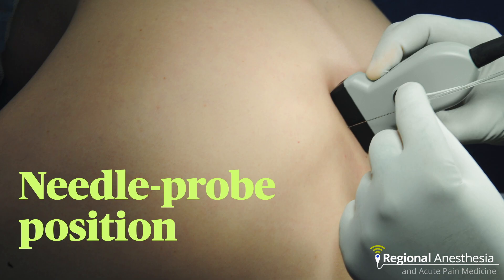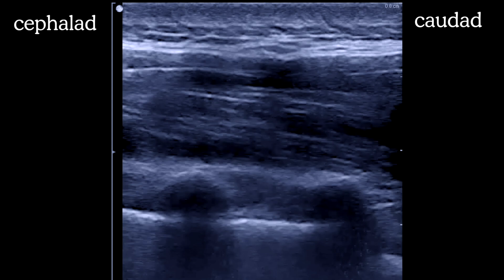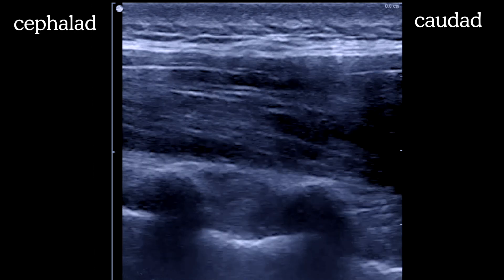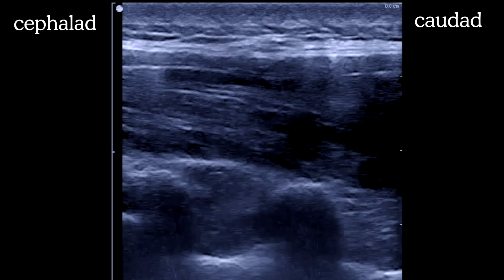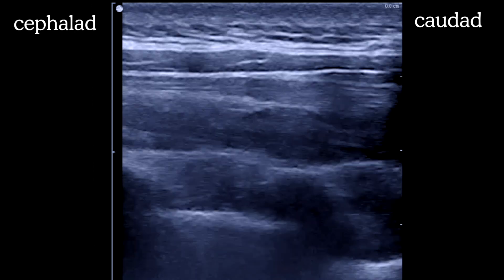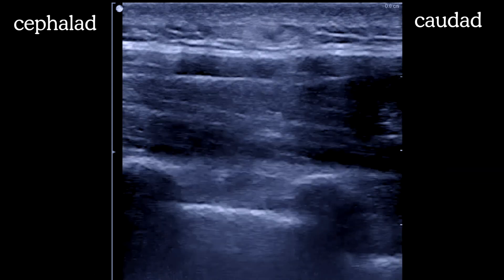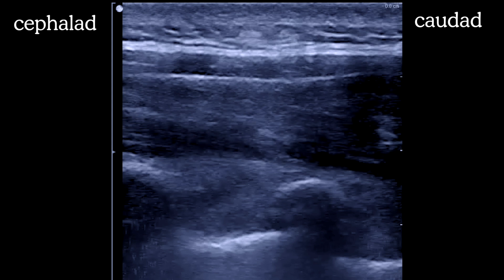Here is the probe position with the needle being advanced out-of-plane. In real time, we see tissue deformation over the centered interspace as the needle approaches the costotransverse ligament, then small puffs of saline are given. On one puff the pleura sinks down. After administering all five milliliters the needle is removed. At the next interspace the process is repeated: the needle comes out-of-plane through erector spinae, a small puff of saline, a little farther, and there is the pleura.